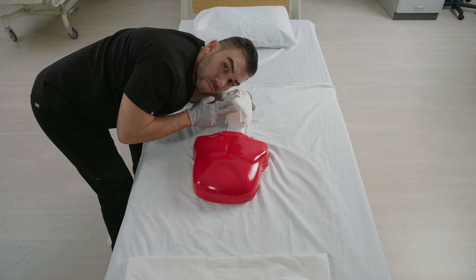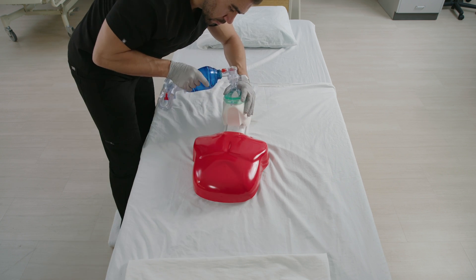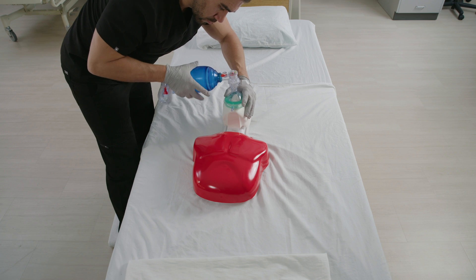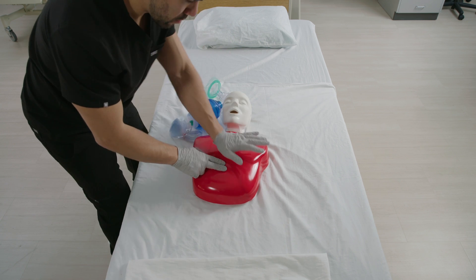Open the airway using a head tilt or chin lift technique and give 2 breaths. Continue 30 chest compressions and 2 breaths until there's an obvious sign of life or until the AED arrives.